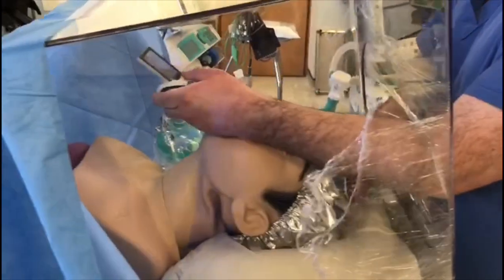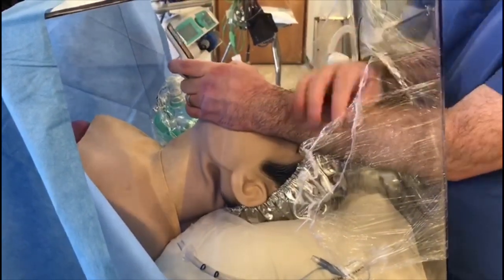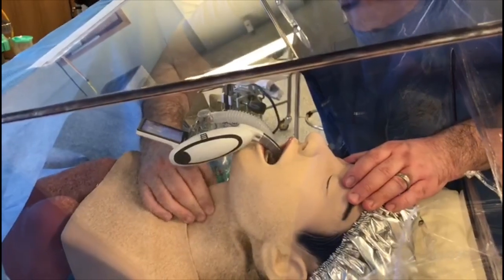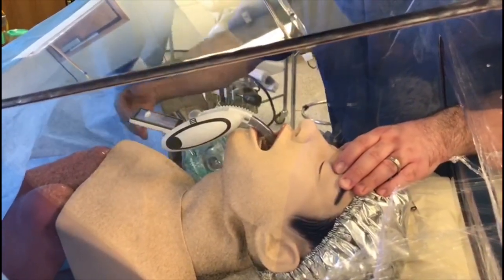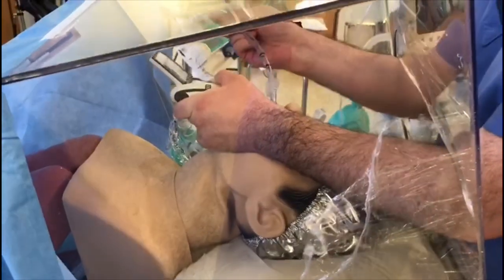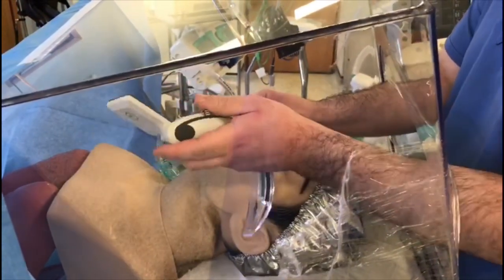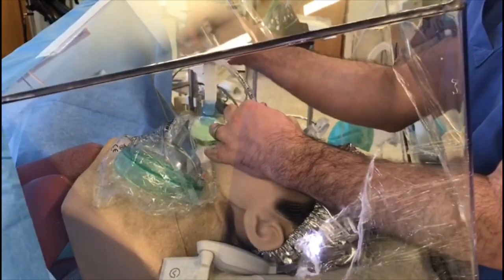Let's just turn this one on for demonstration. This mannequin is actually quite hard to pass the tube in, but we can do it — there's the airway. It's quite easy for an assistant to come around from this side to give cricoid pressure, or to do a manipulation of the airway from outside or hand in an instrument. If we needed another tube, it's quite easy for someone to hand that in as long as they're in full PPE. From the top I have plenty of room to manoeuvre and pass the tube. We have it intubated. We can inflate the cuff with a syringe and close the circuit and tape it up.